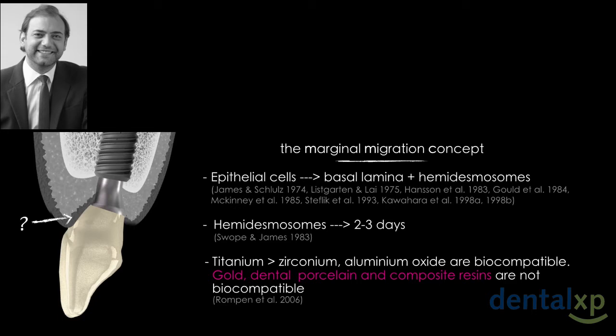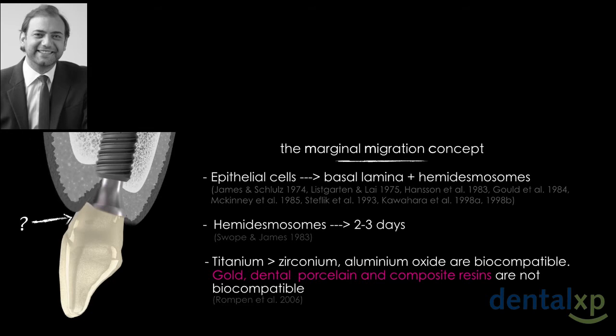In my experience, because we would like to have our first provisional restoration for a long period, 3 to 6 months, it is not stable, because these acrylic materials are porous materials and we might end up with trouble.